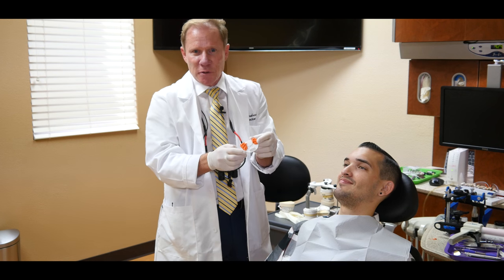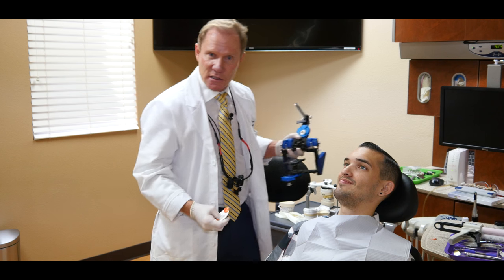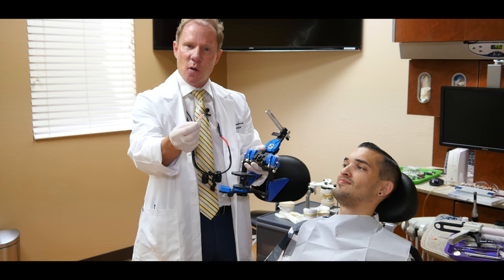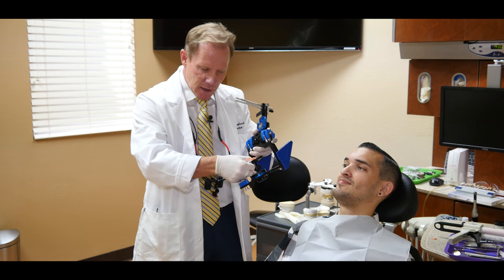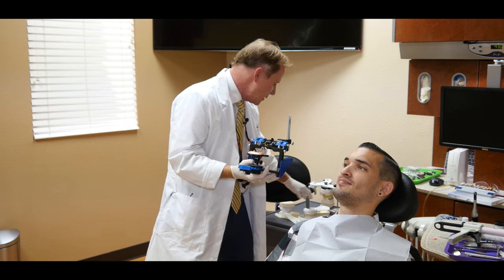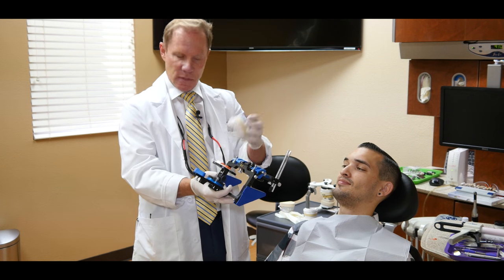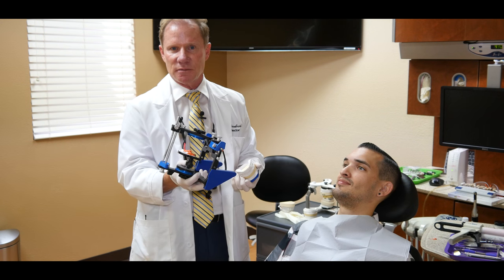So now, what does the laboratory do with this little plate? Well, with both the Stratos and the pen, as I mentioned, the laboratory will have this mounting plate that they mount to the articulator. Then they take the plate that you gave them from the facial dental analyzer and snap it into place, and then they take the maxillary model, seat it into the plate, close the articulator, and mount this to stone.